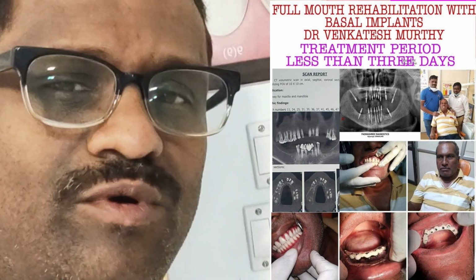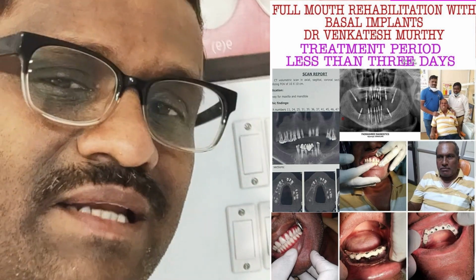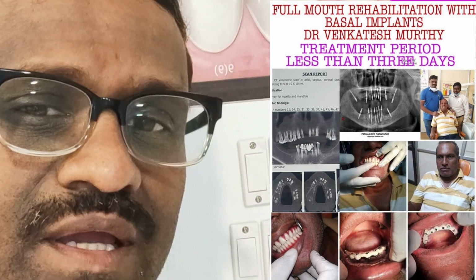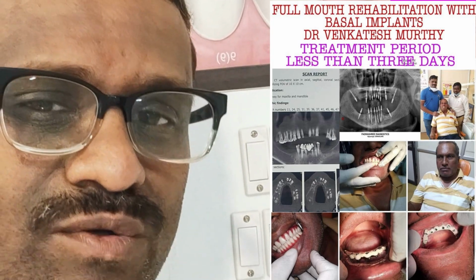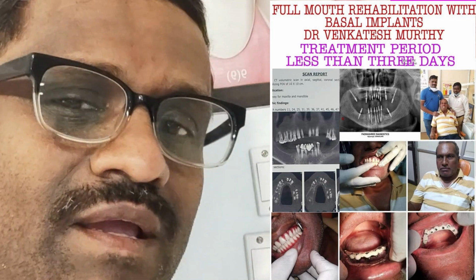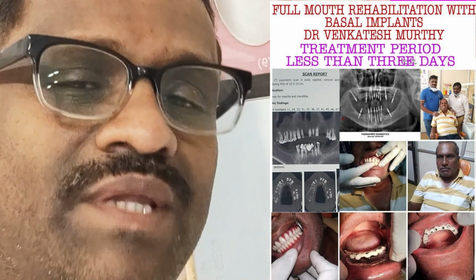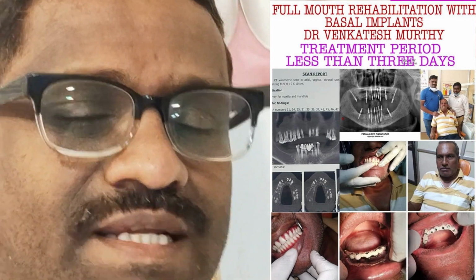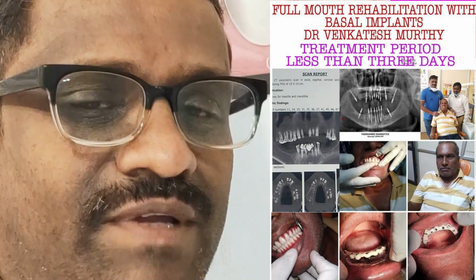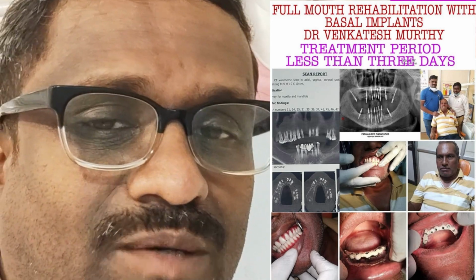Just a brief description about the type of implants which suit a particular area. So, maxillary or the mandibular arch, the implant of choice always is a BCS, that is bicortical screws. In the lower anteriors, you can easily place bicortical screws. I do place compressive implants of length 20 to 23 in the lower anterior mandible and also in the upper anterior maxilla. Sometimes I place compressive implants of thinner dia, that is 3.5. I have placed 4 dia also, but the first choice is always BCS when it comes to any area in the maxilla and the mandible if the bone is available, that is the cortical bone is available.